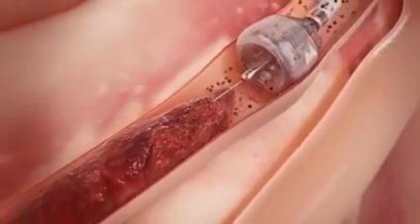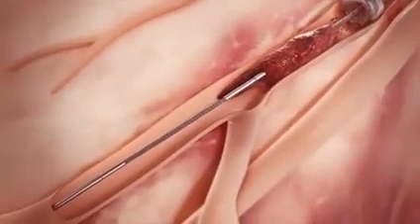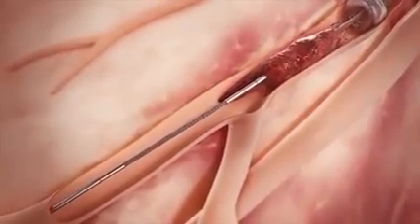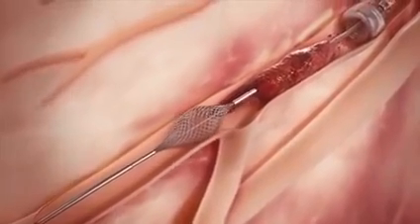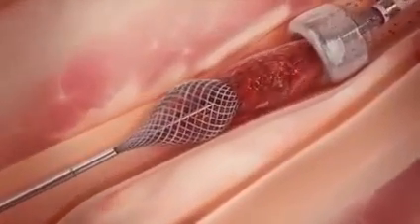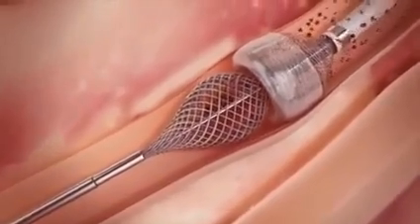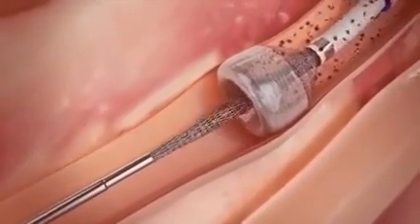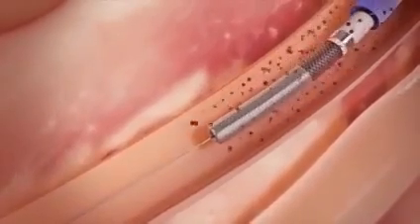Once the MEGAVAC arrests blood flow, the thrombo wire is inserted through the catheter, advanced through the clot, and deployed distal to the clot. While applying suction with the MEGAVAC, the thrombo wire is retracted to simultaneously pull the clot into the funnel mouth and through the catheter. After complete clot removal, suction is discontinued and the catheter tip is undeployed, restoring distal blood flow.